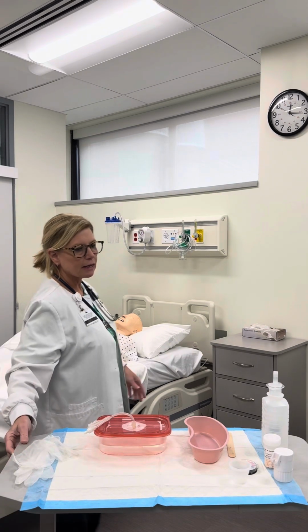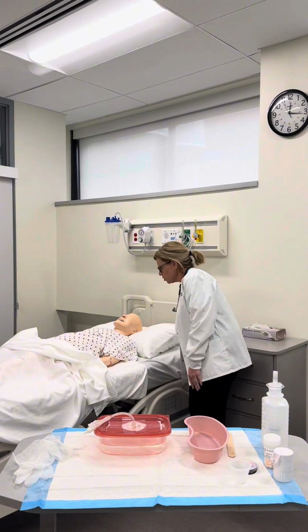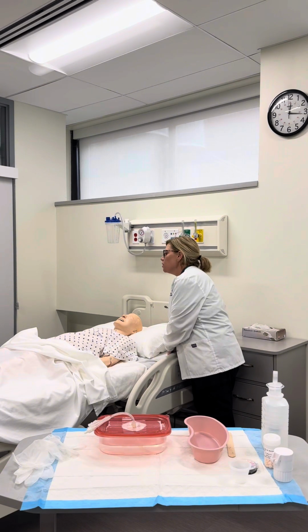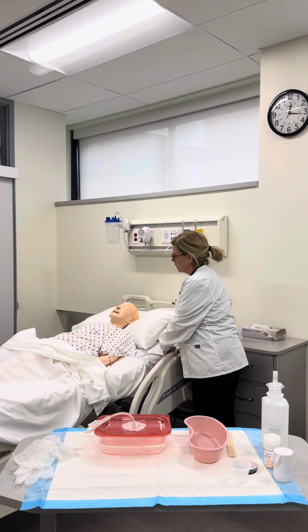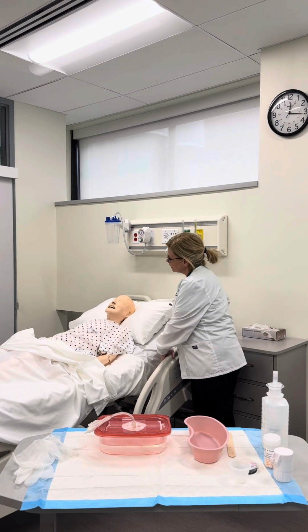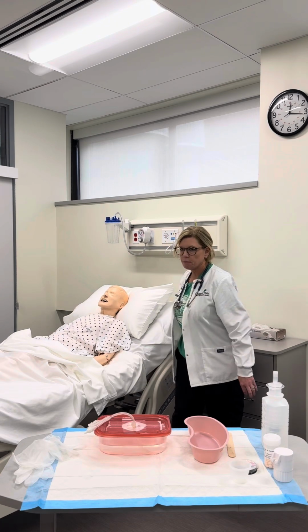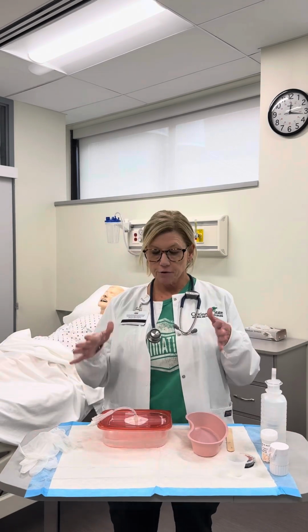Okay, before I give anything through the G-tube, I do want to make sure that my patient is elevated, that they're sitting up. So the head of the bed should be up 30 to 45 degrees. So I'm going to go ahead and sit them up, get them ready for their G-tube medicine, okay? And then I'll come over here.